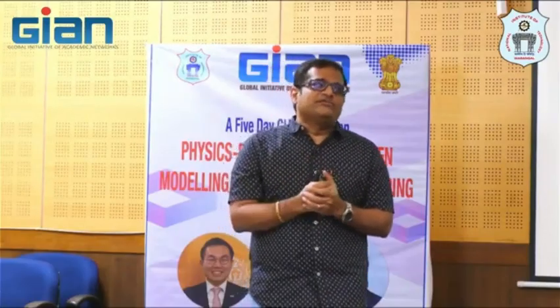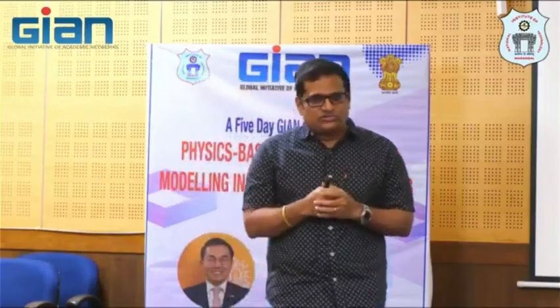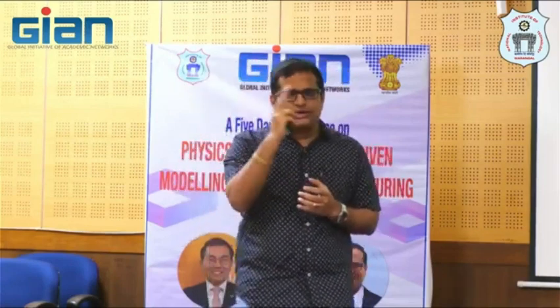Or otherwise commercially, initially we had one case printed from Israel, because they give a certification along with the implant which you print. We send the design, they print it. In India, some people are printing and fixing it, but care should be taken with all these processes.